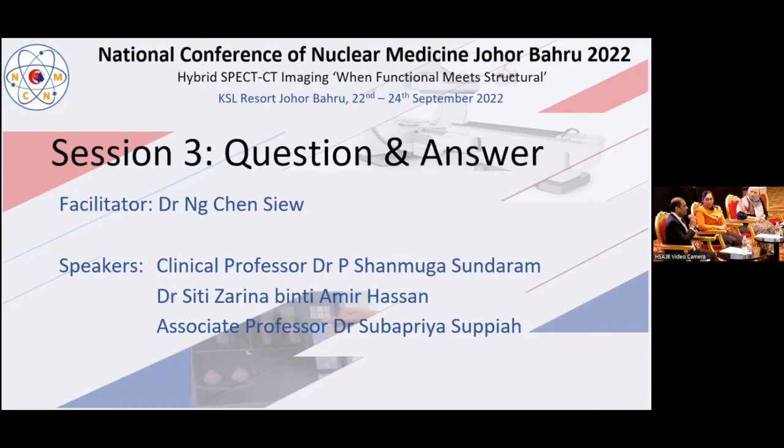But what is very important in our day-to-day clinical practice is majority of the time, even though we are doing a follow-up scan, if we are doing again with contrast, the target to background ratio or the SUV values may not change much. So if there is a reduction, we know that it is a real reduction due to chemotherapy or any other intervention. Problem comes when we are following these patients with non-contrast CT. So that has to be kept in our mind.